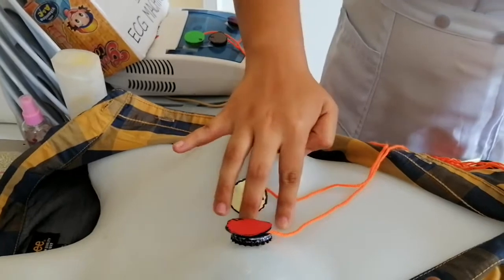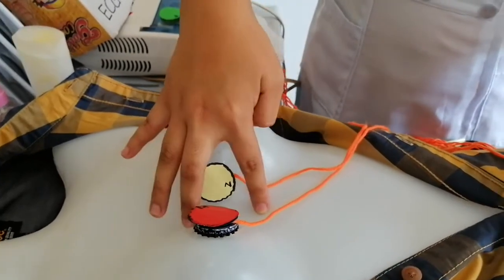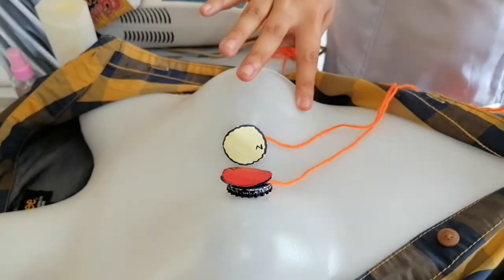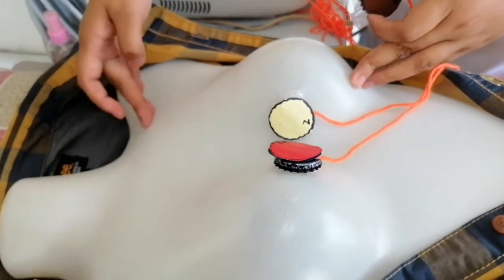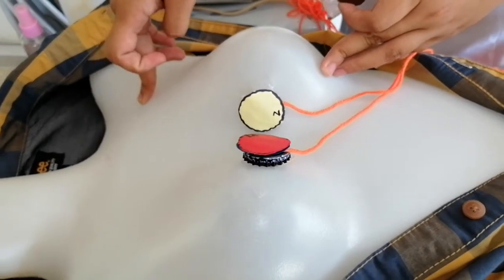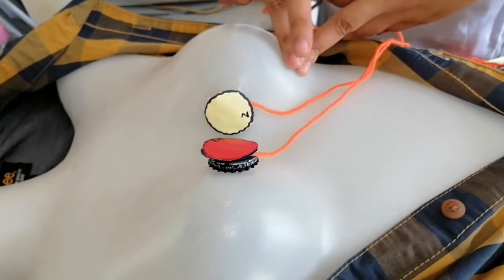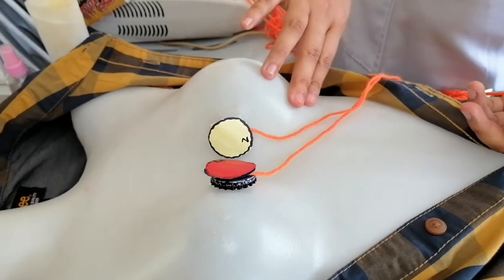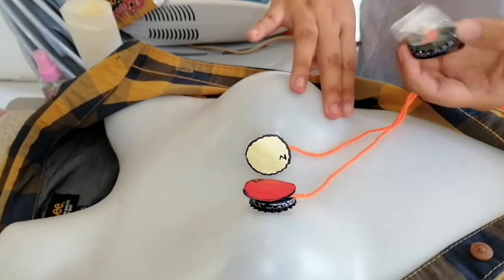From this xiphoid process, you're just going to draw a lateral line going to the left part of the breast. And you also need to draw an imaginary line going down from the mid-clavicular line of the clavicle until they meet each other. After doing that, this is now the fifth intercostal space, or the apex of the heart, wherein we are going to place the V4.